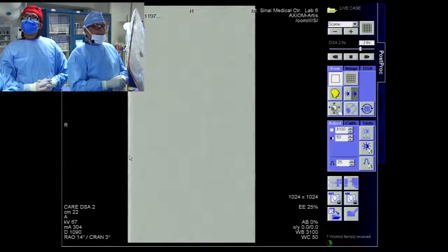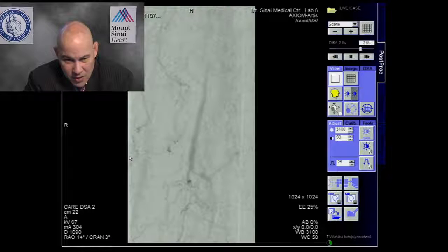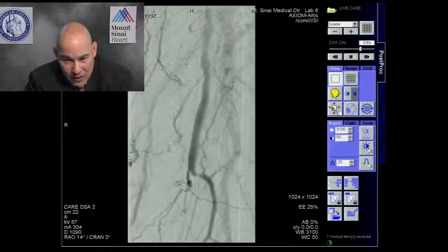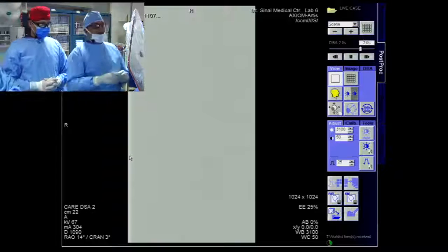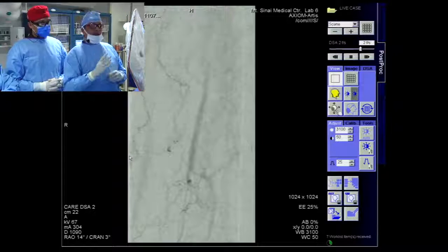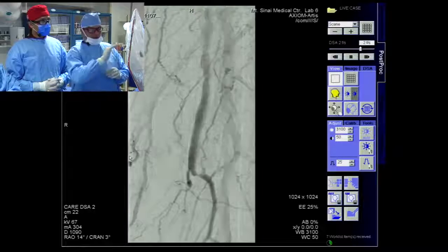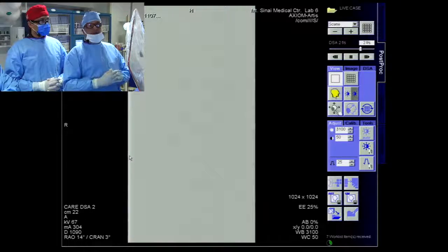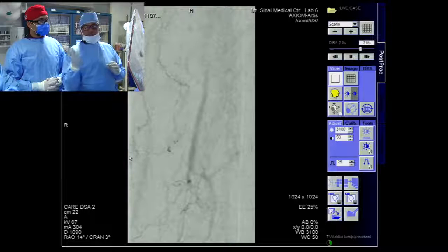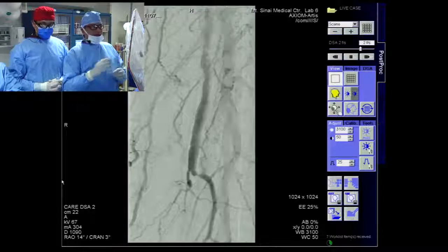The challenging aspect here is those collaterals — without robust collaterals it's easier to advance and cross the CTO. You must look at multiple views to identify the stump clearly. If this were a blind pouch — a complete stump with large collateral and no beak — it would be more difficult to cross than a stump with a small beak. Multiple collaterals make crossing even more challenging. Looking at the anatomy tells you exactly what approach to plan.